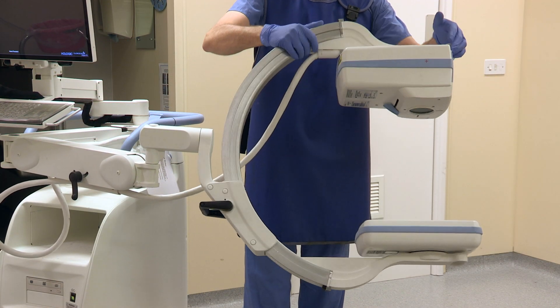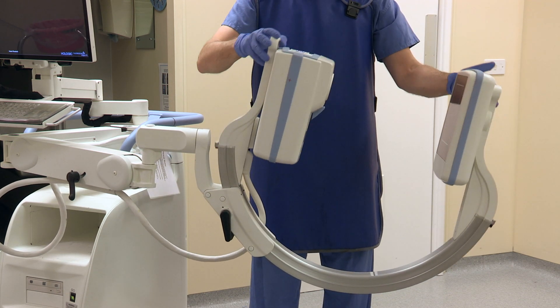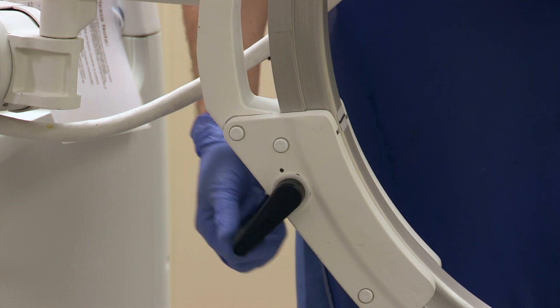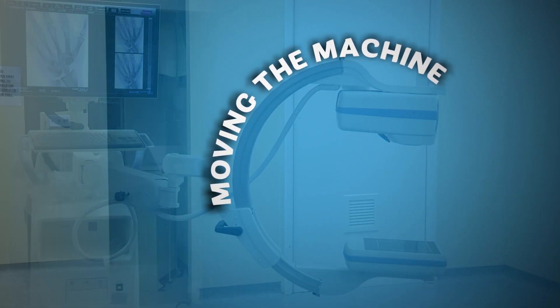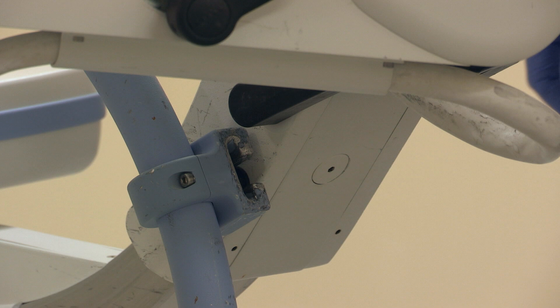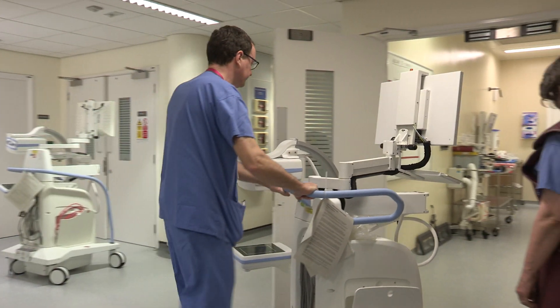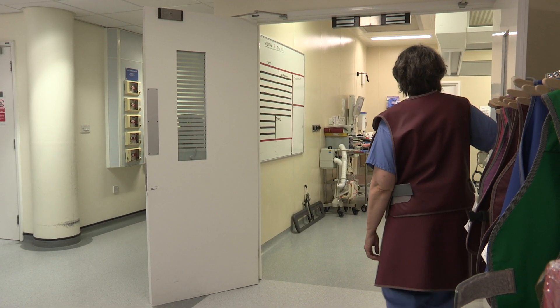When positioning the C-arm, release the catch and position the image intensifier as shown. If there is a catch for the actual C-arm, make sure that the arm is restrained before moving the machine. Move the machine slowly — this is an expensive piece of kit and you're not in a race. Make sure you have enough space to manoeuvre and check that the theatre doors are opened sufficiently. If necessary, get a buddy to help.